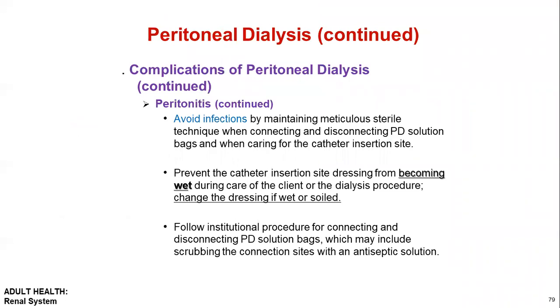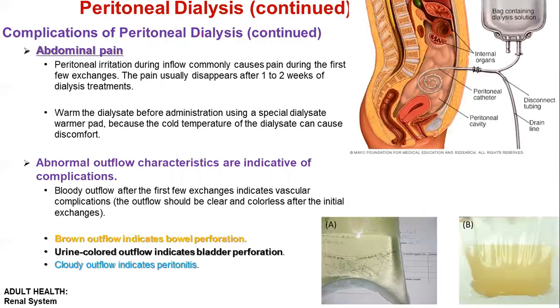So how will we avoid the infection? Avoid the infection by maintaining meticulous sterile procedure and preventing the catheter insertion site dressing from getting wet, or changing the dressing if it gets wet, right? And always following institutional procedure and protocol.